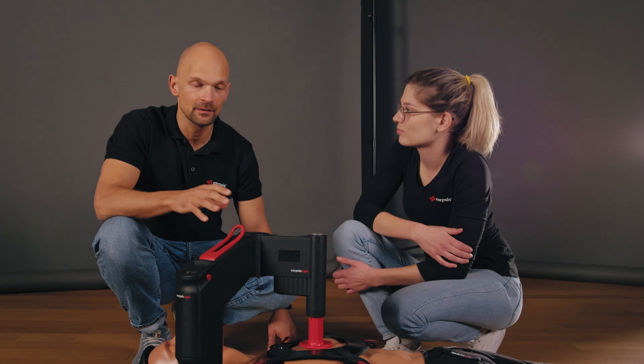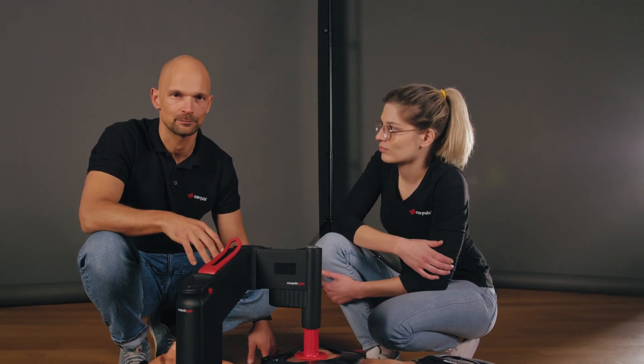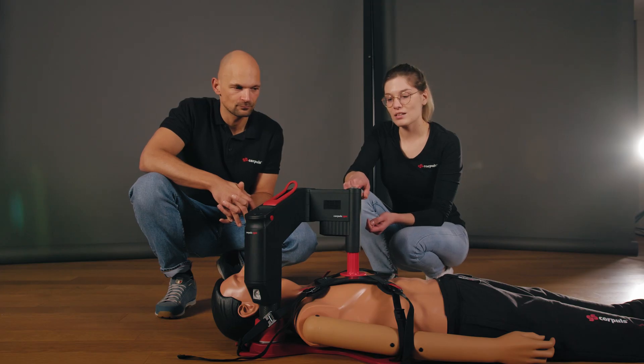As a general rule, if an alarm or problem occurs that cannot be resolved immediately, switch to manual compressions right away. The corpuls cpr signals an alarm in three different ways: first, an acoustic warning tone; second, a symbol on the display which can indicate the possible cause; and third, an LED that lights up in different colors.